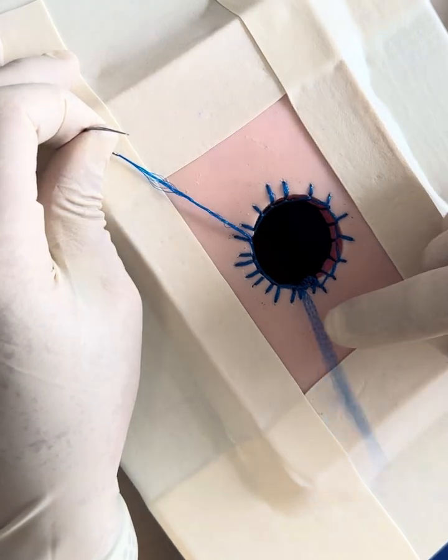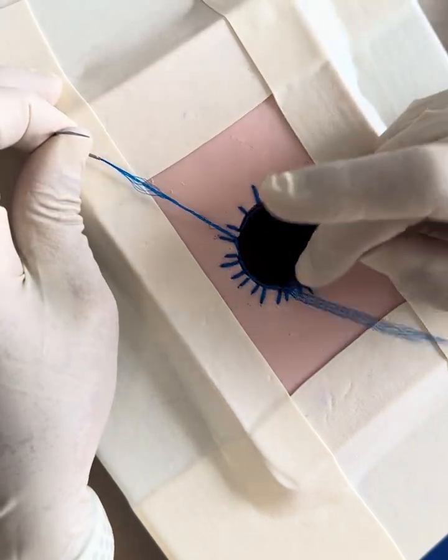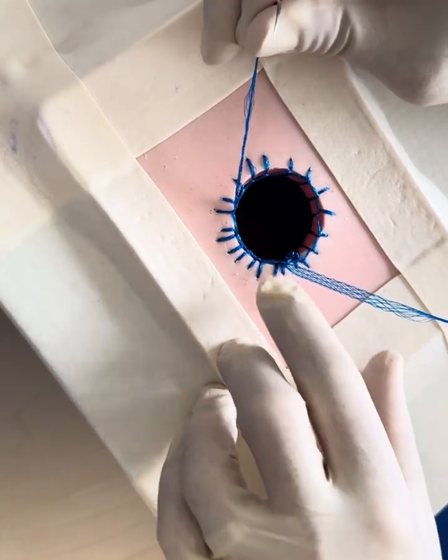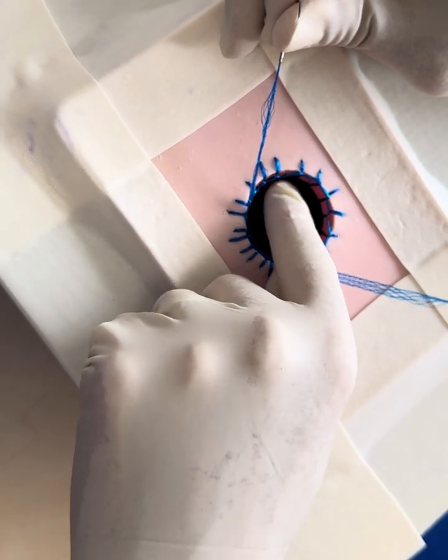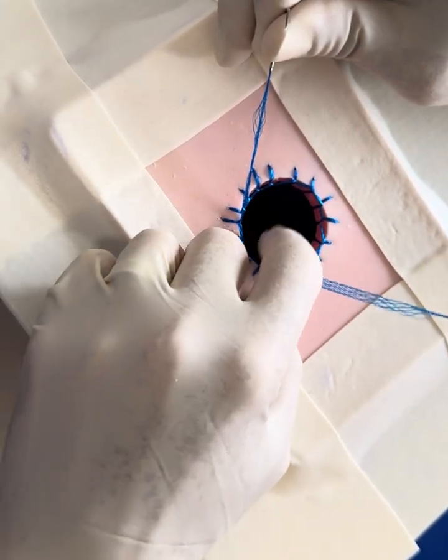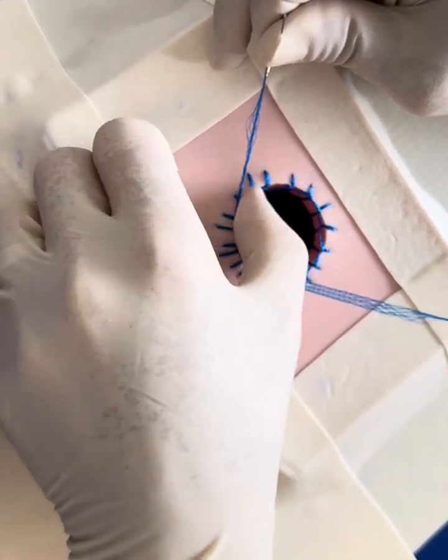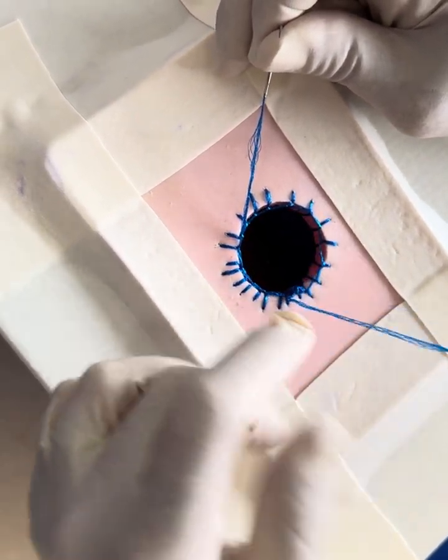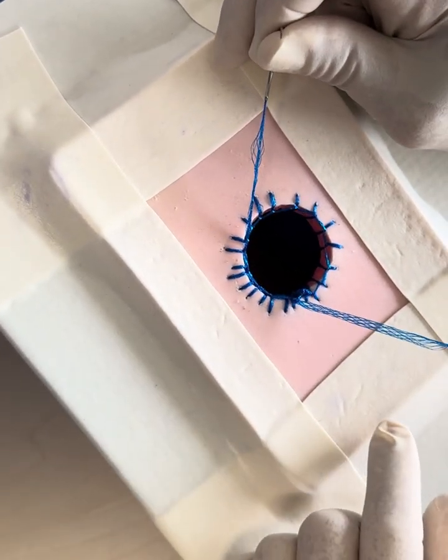And you can just keep on doing this, going round and round and round. Usually it takes 2 or 3 times round and you've got a lovely repair, but you can do 5 or 6 times round, and I think that then demonstrates how it holds the circumferential strand of the mattress repair directly up against the tissue, so it's not free floating to cut into the bowel. There's no sharp feel to it. It sits there nicely, and the bowel comes through, and there's no risk of cutting in. The knots sit nicely, so very straightforward.